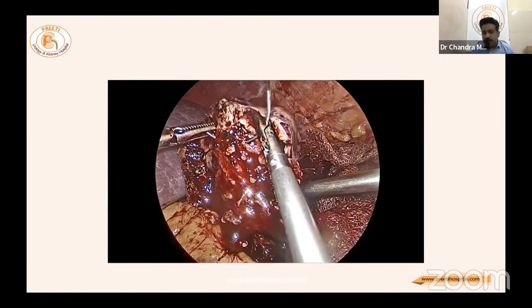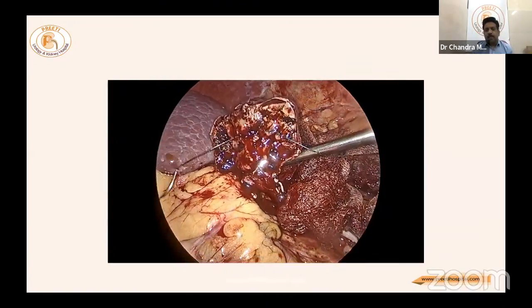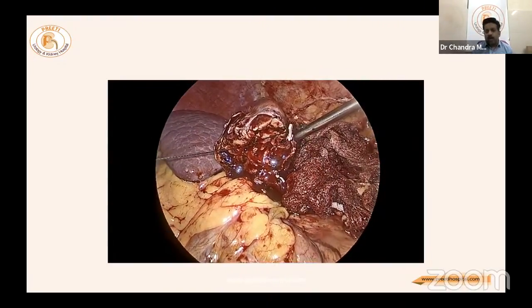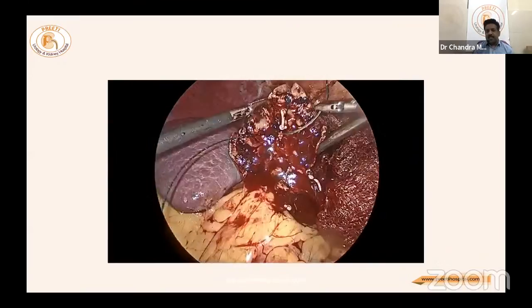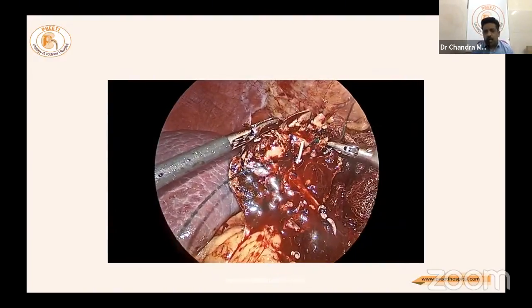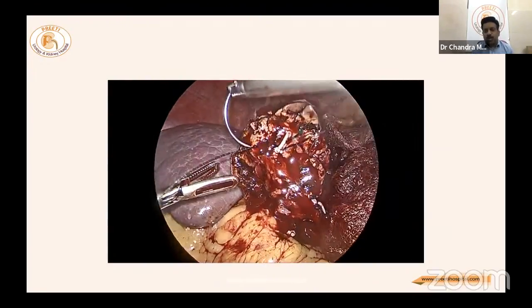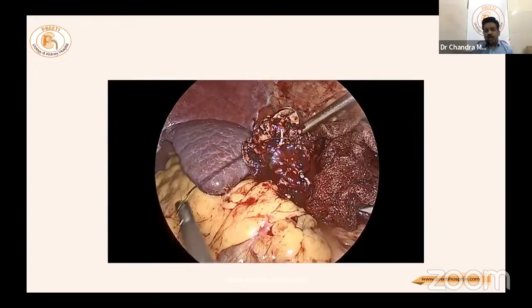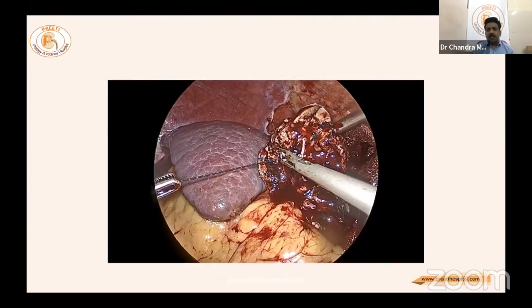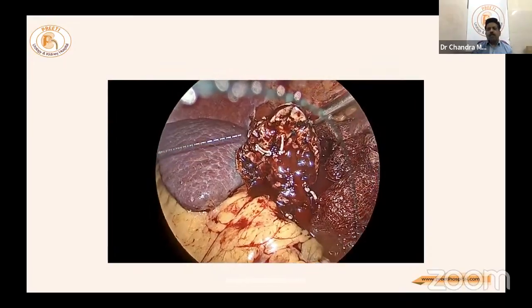This is especially essential at the infundibular region of the upper pole — do not take deep bites. Very superficial bites of a few millimeters, two or three bites — V-lock or any barbed suture is very useful here. It simply approximates the tissue, and that is more than enough to stop the bleeding.